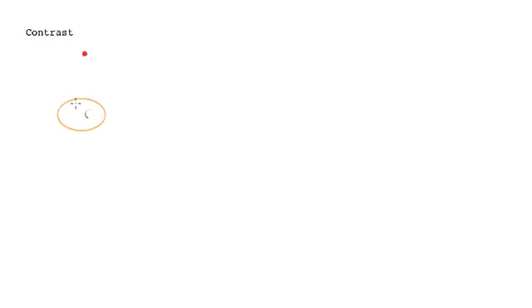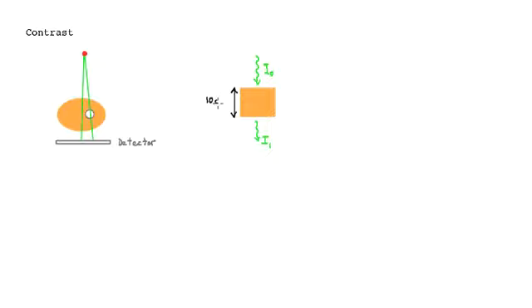Now we're going to image something. Let's say it's an arm, and there's a bone inside, and we're going to image it with a detector. I'll talk about detectors in a few minutes. Now let's consider two photon ray lines, one coming through the bone and one through the soft tissue, the muscle. To understand the math, let's make a cartoon. Here's a thickness of tissue, photons come in with some fluence I0, and what comes out is fluence I1. The thickness of this tissue is 10 centimeters in this example.